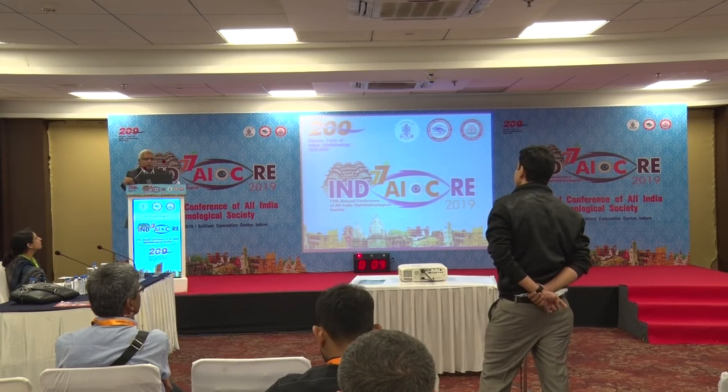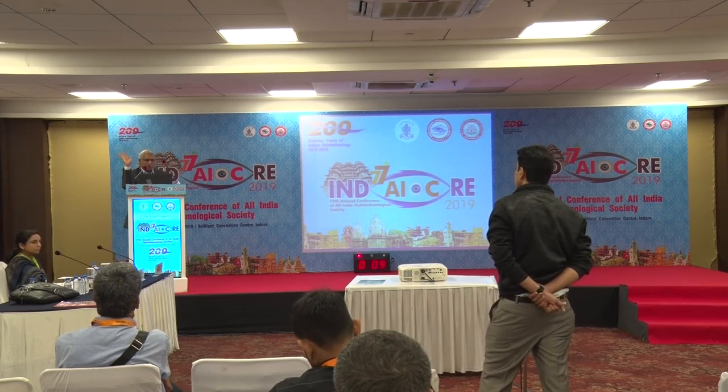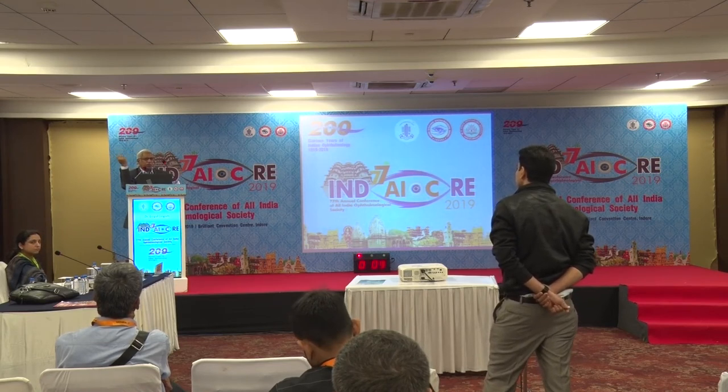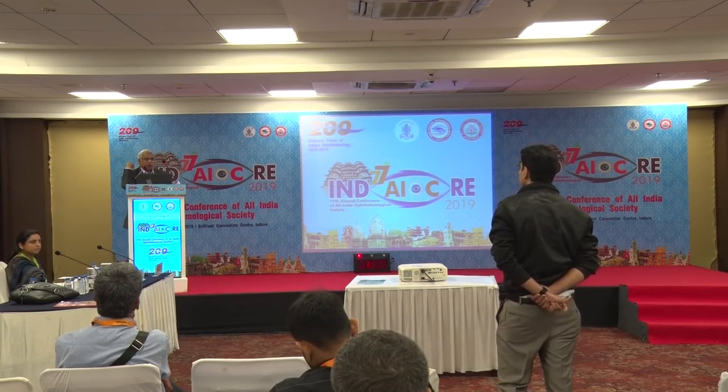Fellow eye, okay. Fellow eye, as I said, presence of an ICM break on the day that you're doing prophylaxis, or absence, doesn't mean it will not form later, right? So our aim is to, as I said, segregate the entire coloboma from the rest of the retina, so you reduce the risk of detachment in the future, okay? Despite your laser, it can still happen, but let us do what we can.